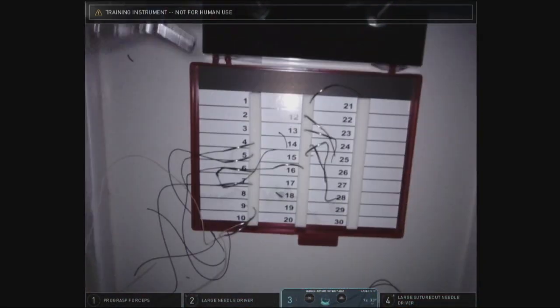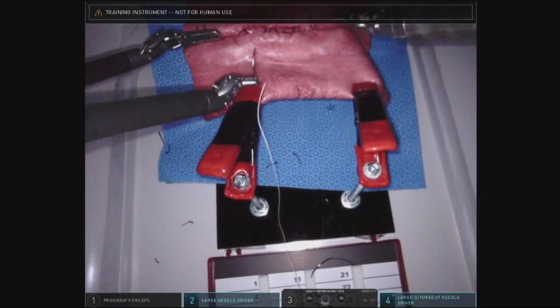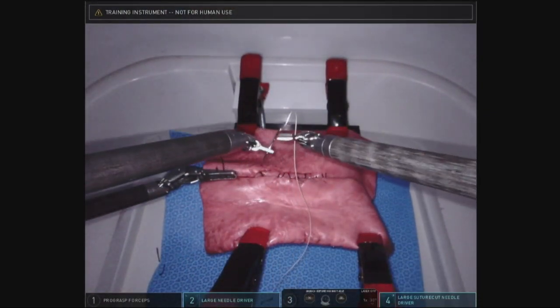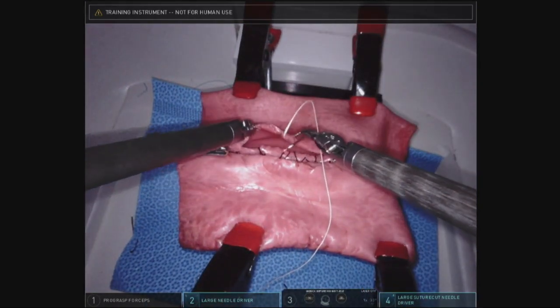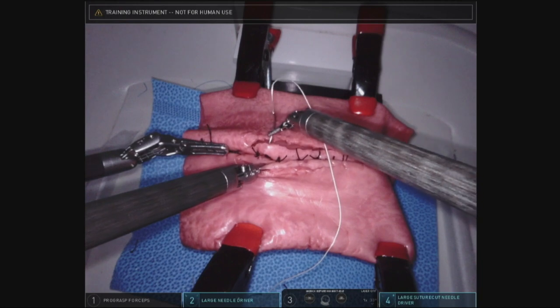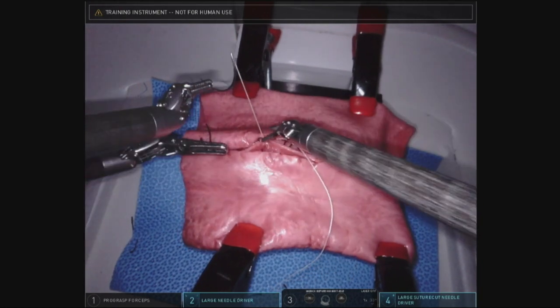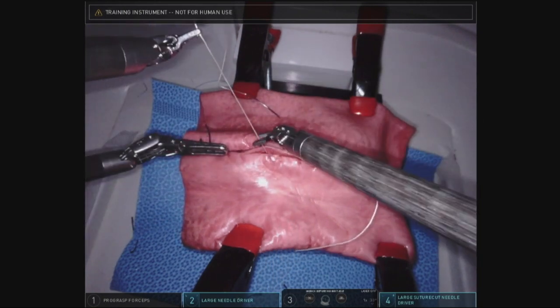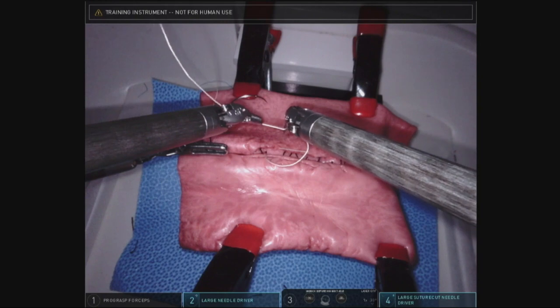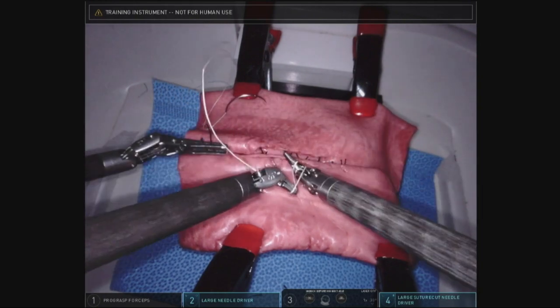Switch back to your suture cut needle driver, and for the inner row we will use 3-0 vicryl sutures. For the running suture, we will anchor the first stitch on the posterior wall. So we're going to tie this suture here. There's a lot more suture to pull through because the vicryl is about 9 inches to enable you to complete the anastomosis.